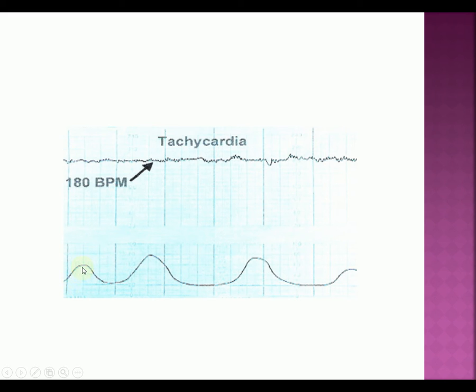And the peak of it, if we have an IUPC in, the peak of this one looks like it's probably around, let me get a hold of my mouse. Where'd you go, Mr. Mouse? I think they just disappear and appear whenever they want to.